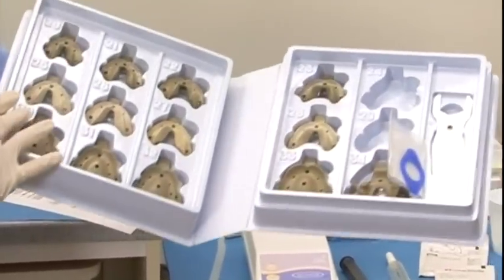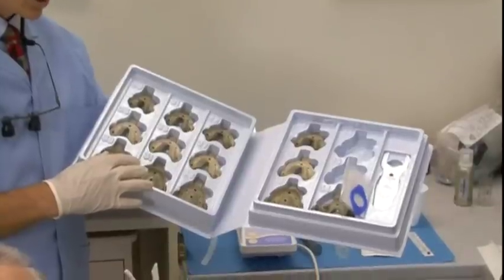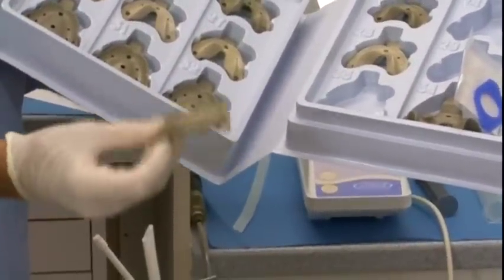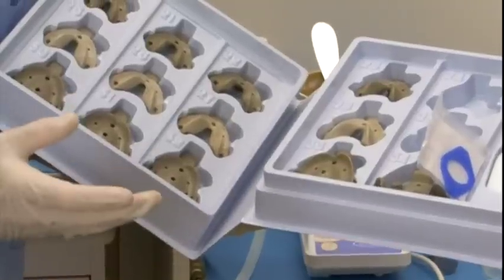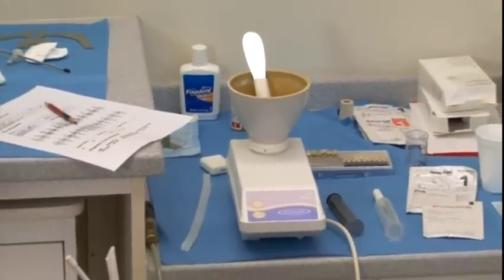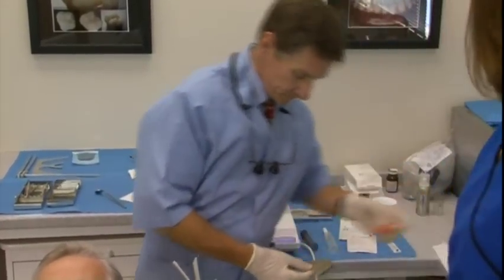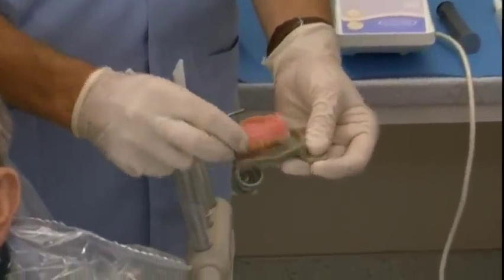The system also comes with a whole series of trays to select from. The edentulous trays come in a little box and the trays are perforated. One of the things we do is use the patient's existing denture to select the tray — if the denture fits in their mouth at all, it's going to be pretty close to what we can use. We've pre-selected a tray for Mr. Bothy, and his upper denture fits in there just like that, so that tray is going to work pretty good.